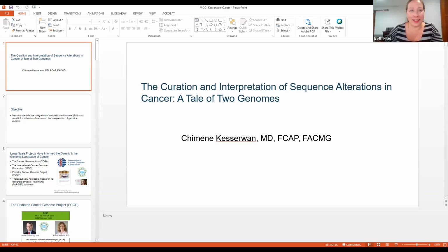That sounds good. I've even heard of people kind of venturing into trying to use cheek swabs instead of blood. Yes. So at NIH, we have validated the platform that is currently running. We validated on saliva. We are doing tumor normal at NCI in the laboratory of pathology on peripheral blood and on saliva.